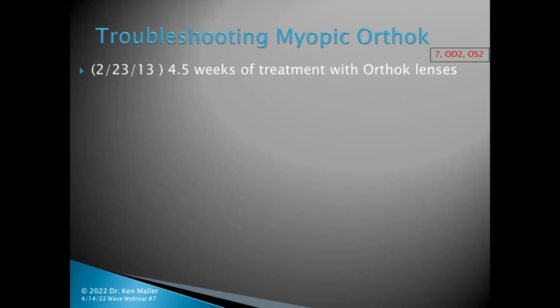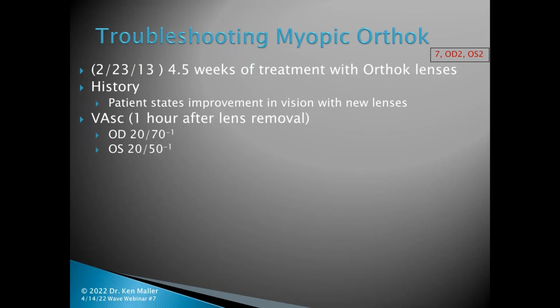For the 7th visit, he came in wearing OD 2 and OS number 2. He's 4.5 weeks into treatment with Ortho-K lenses. And the patient reported that the vision had actually improved with these new lenses. After 1 hour of removal, he's 20/70 and 20/50. And so it still doesn't look very good to me in terms of his uncorrected vision. And this is actually only 1 hour after the lenses have been removed.